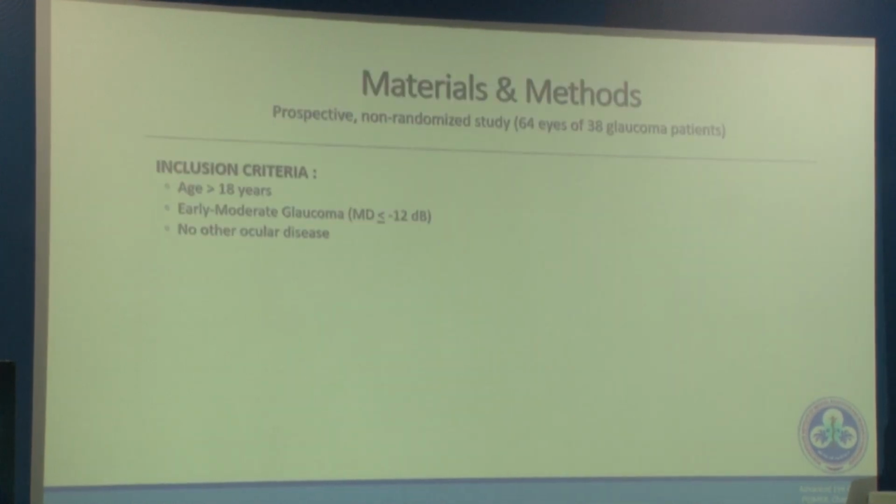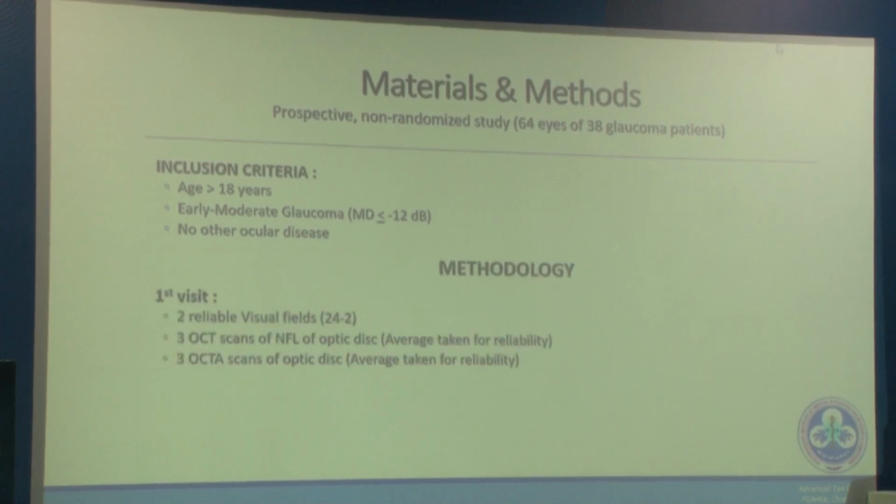So ours was a prospective non-randomized study on 64 eyes of 38 glaucoma patients. The inclusion criteria were age more than 18 years. We included patients of early to moderate glaucoma with no other ocular disease.